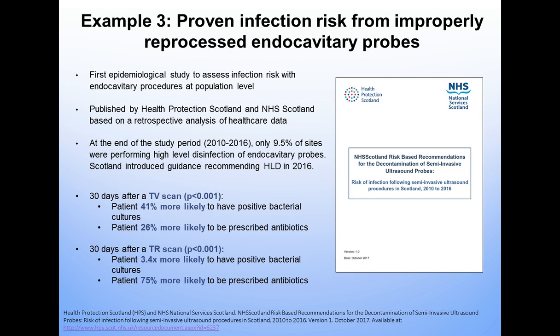And this kicked off a review in the UK of ultrasound probe reprocessing. A number of countries have since brought out guidelines requiring high-level disinfection for endocavitary probes. The Scottish guidelines only came out in 2016. And prior to 2016, people were actually broadly performing low-level disinfection of endocavitary probes.